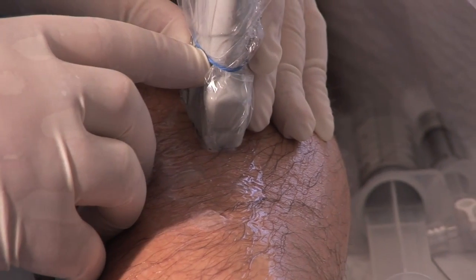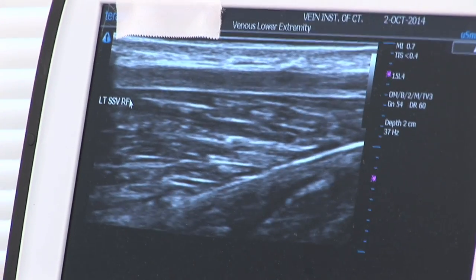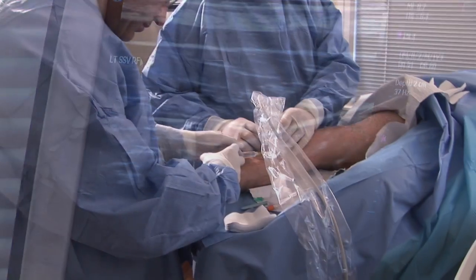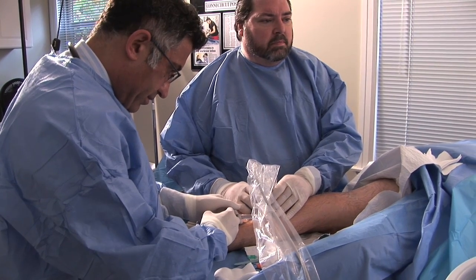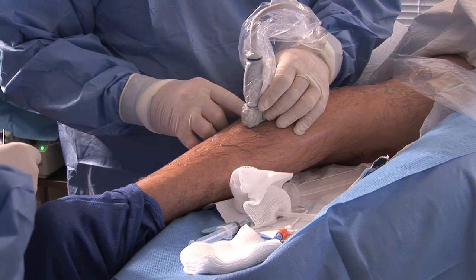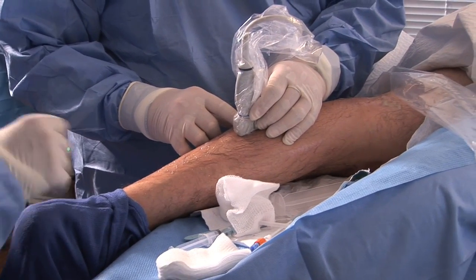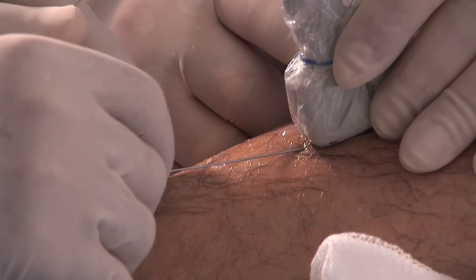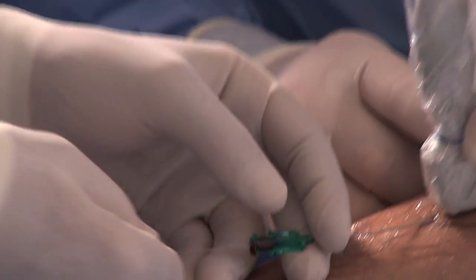after a small local anesthesia, we are going to gain access to the vein, which is that top dark strip that you see on the monitor. After local anesthesia, access is gained by a long needle which will help us introduce a guide wire into the vein. The patient does not feel anything at this point. There is no pain, and as you can see from the flashback, and then we'll confirm on ultrasound, we have gained access into the vein.